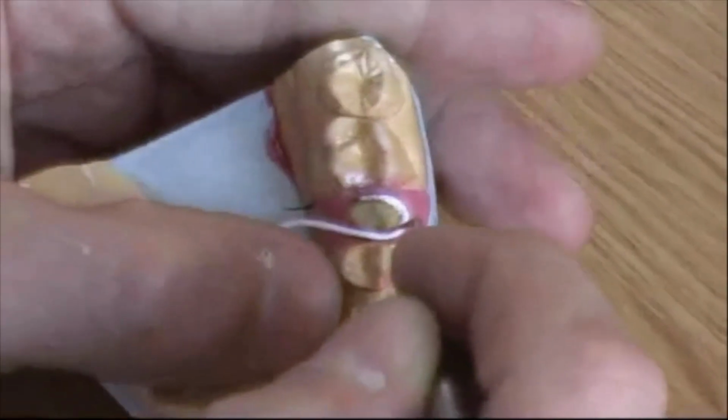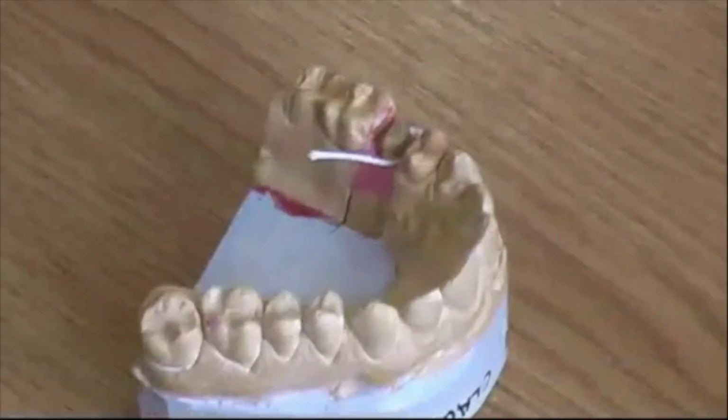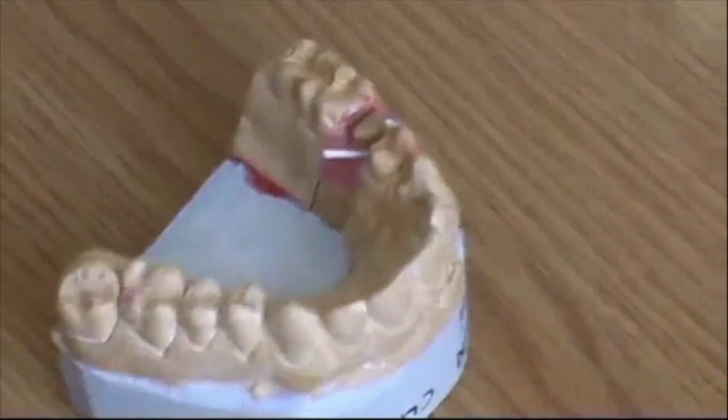Again, we'll talk about this again when we do dental materials in the 3rd grade. So again, you want head-to-head closure of the cord, of the retraction cord.